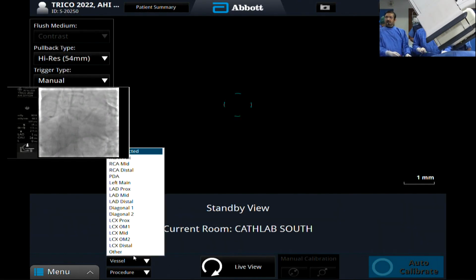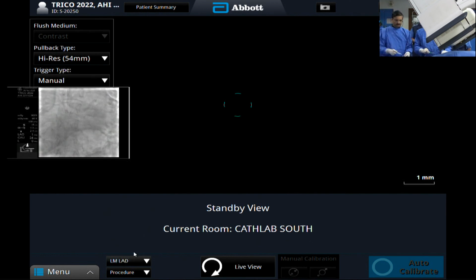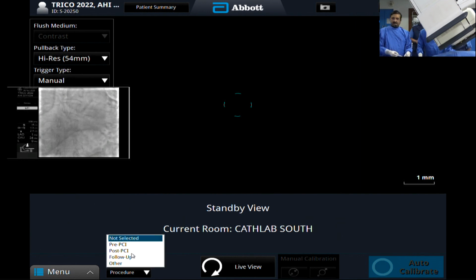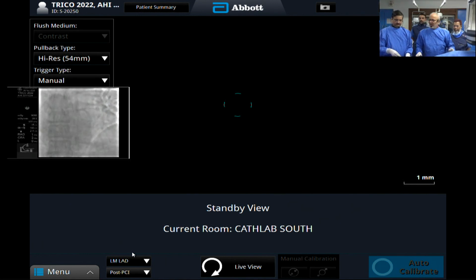Samir, you wanted to see the 360-degree subclavian loop. Let me first inject and check this. Go to AP. Get me a blunt tip of the wire.